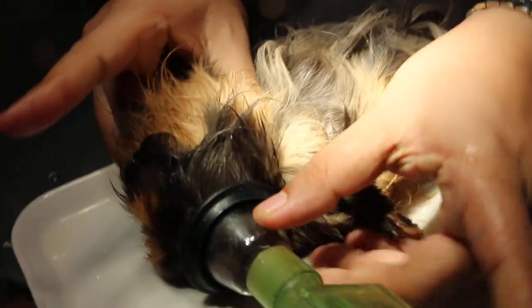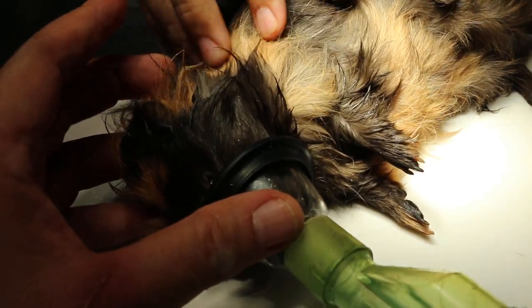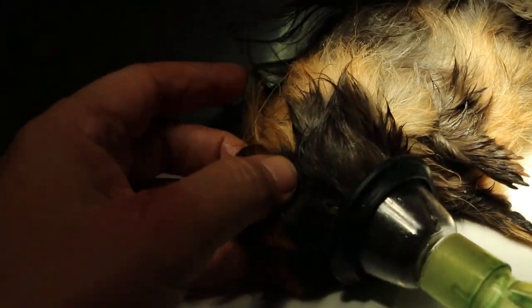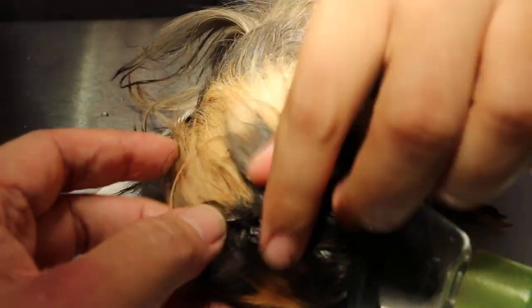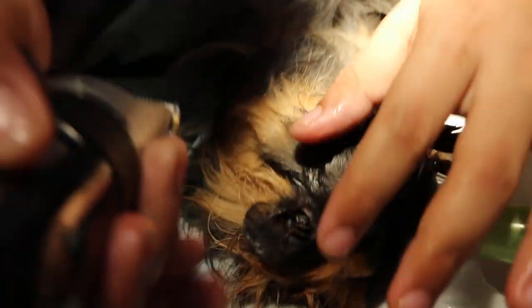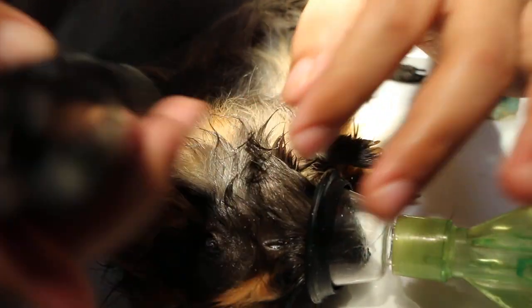We need to gas again. Just a short gas — 5%. Shave the hair a bit so there's more ventilation.